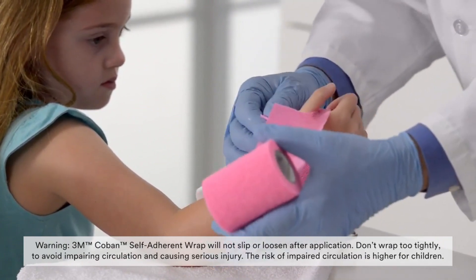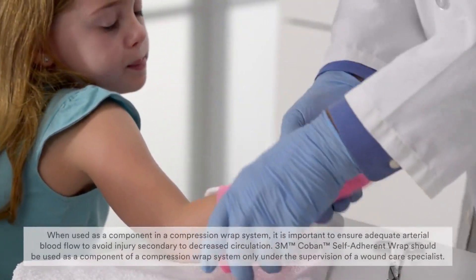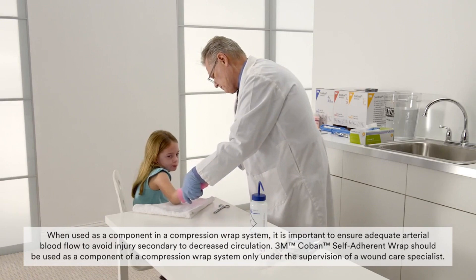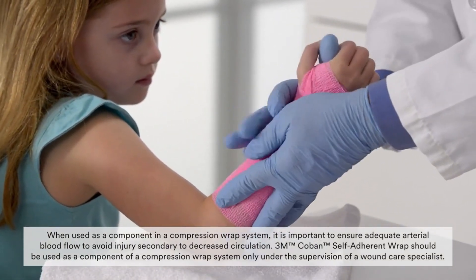Then wrap proximally, overlapping each rotation by 50 percent. Mold the palm of the splint by holding the patient's thumb between your thumb and forefinger and pressing the ball of your hand into the palm of the splint.